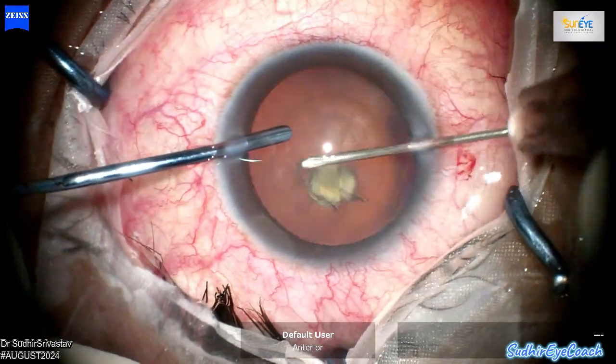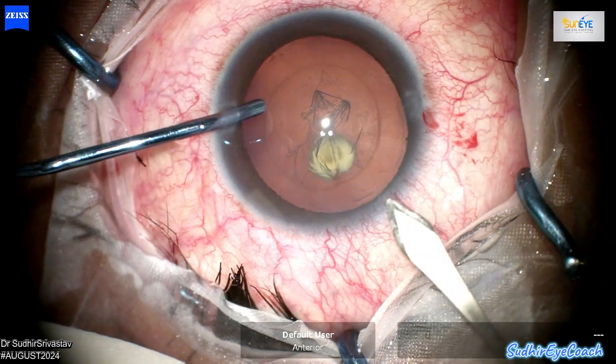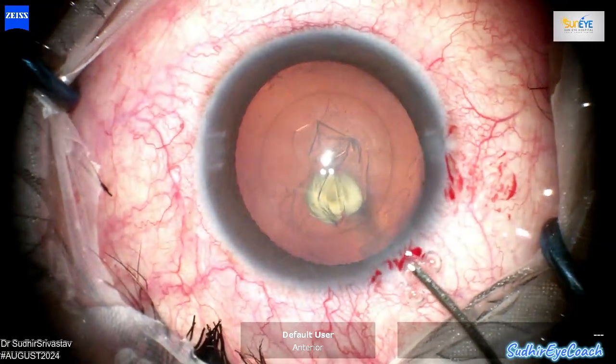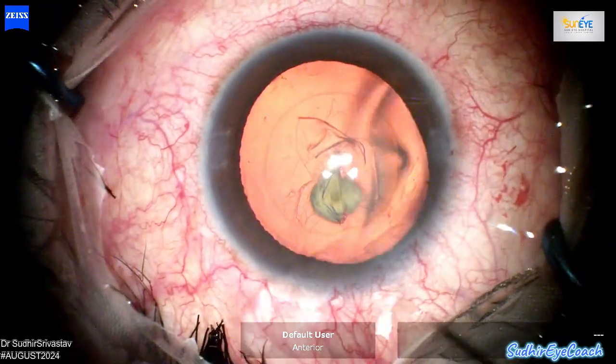In these cases, I usually perform a standard capsulorhexis aiming for a well-centered circular opening of around 5 or 5.5 mm. Maintaining a consistent circular capsulorhexis is key for the stability and optimal IOL placement.